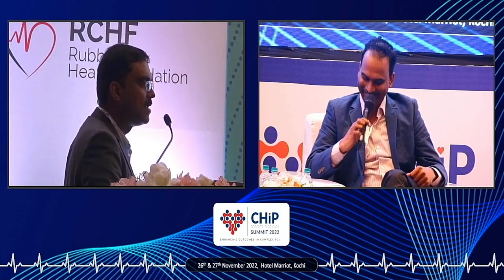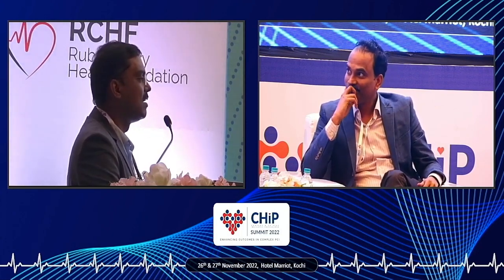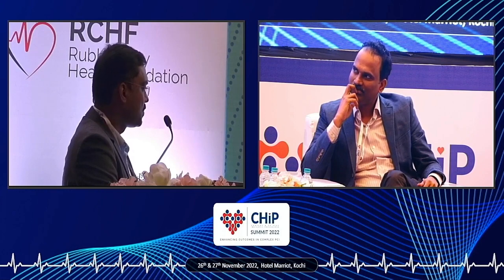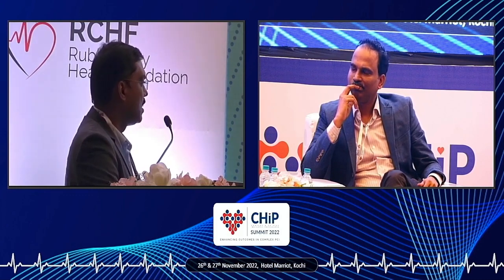A nice thought, and in fact, my approach to LMCA PCI is more than 80-90% provisional only. I still follow Goran's rather than the Chinese philosophy. Unless the patient goes in for a complication like bailout, my approach remains provisional. Whatever the DK CRUSH trial data told, that the data is superior, I still feel the provisional approach is better. And in some cases where I feel some dilatation should be done in a provisional approach, I usually do a DCB the first time itself, final kissing balloon with a DCB.